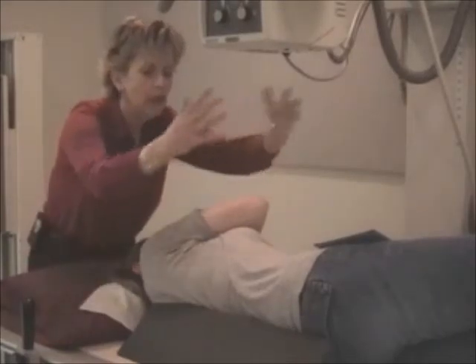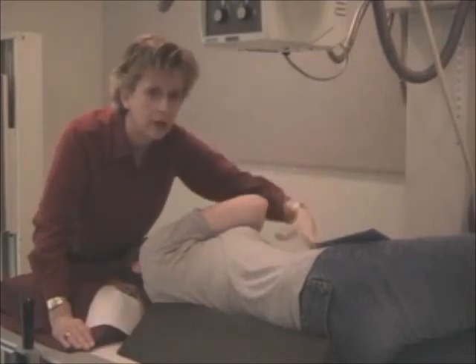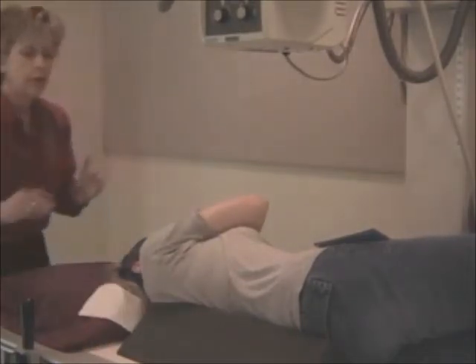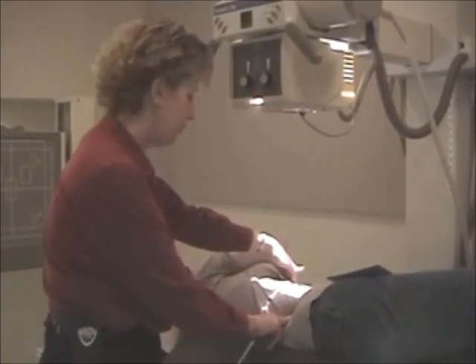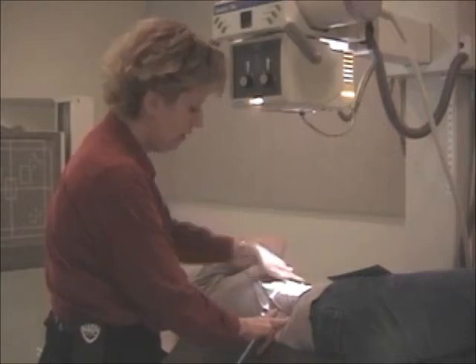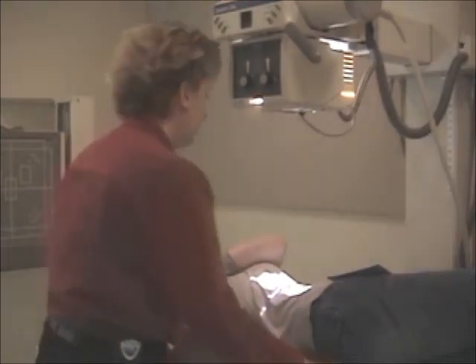Now, if a patient is really obese and the tissue falls this way, you're going to have to shift and be centered more over here. Okay, again, you have to use some logic in finding the stomach side to side. Okay, I've centered her body and I am 2 inches below the xiphoid. Again, that's approximately the level of L1 or L2. Here's the crest. 2 inches above would be L3. So you can see I'm approximately L2. So I'm happy with that centering. Okay, we're going to let Kristen relax for a minute.